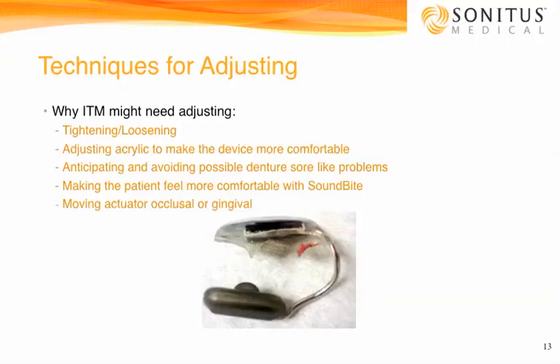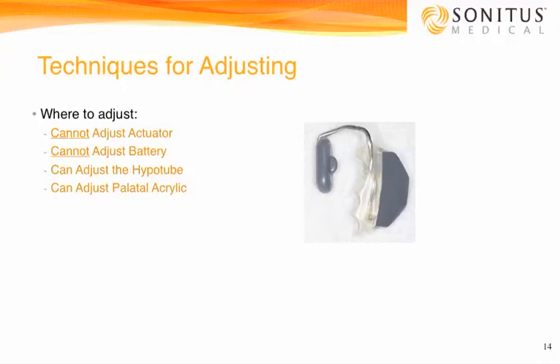In my experience, probably about 10 to 15% of these have to be adjusted. Even if the lab has upper and lower full arch impressions and everything possible, mounted casts or whatever from a high level of dentistry, you still need to adjust these from time to time, because these are resting on the soft tissue, and when these get between the teeth and the soft tissue, you hit them a little bit. It's really not that hard to do.